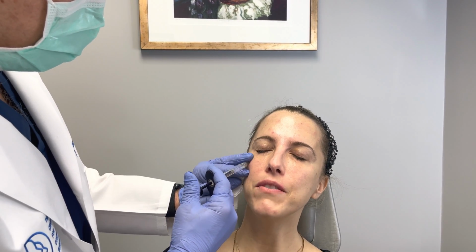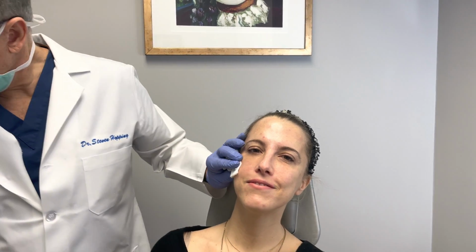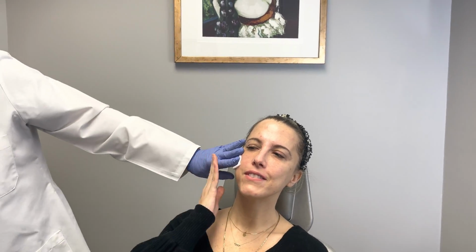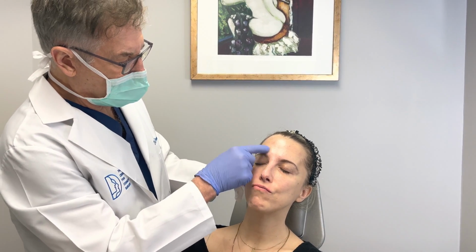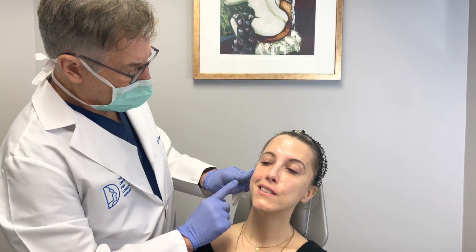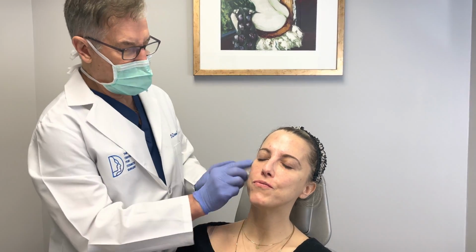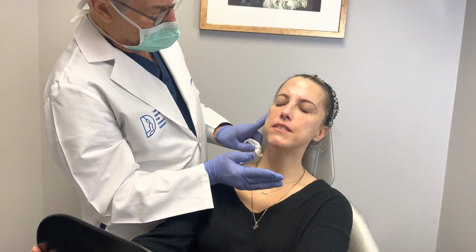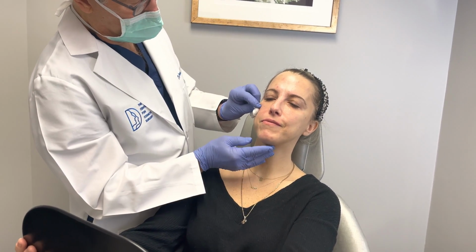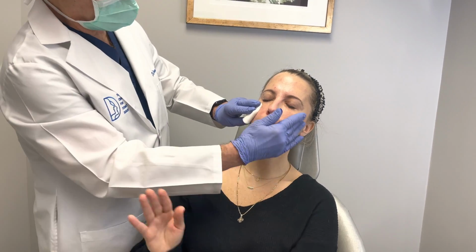Okay? I'm good. So again, I'll put a little bit of our special secret anti-bruise sauce on there. That's not a bruise, that's a little blemish that she has. But yeah, take a look in the mirror now. See how you're more oval on that side? You see that, Marsha? Okay. So we have a little pressure here, and we'll do the other side.